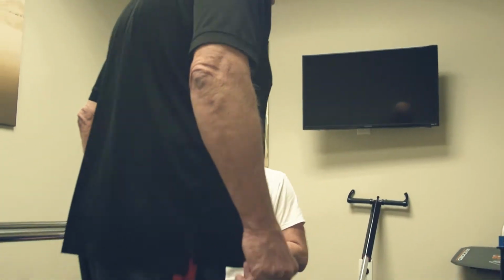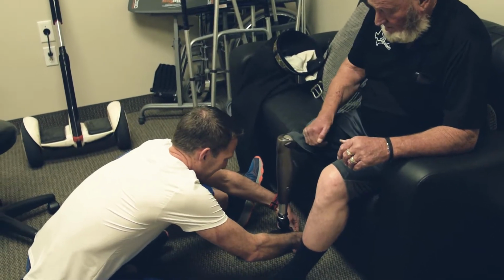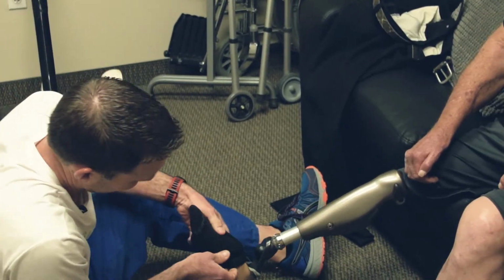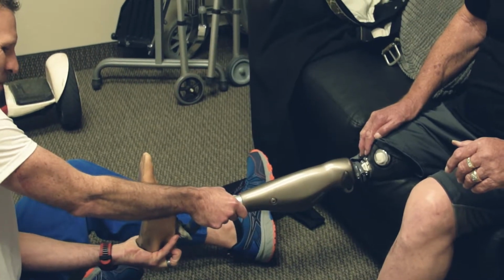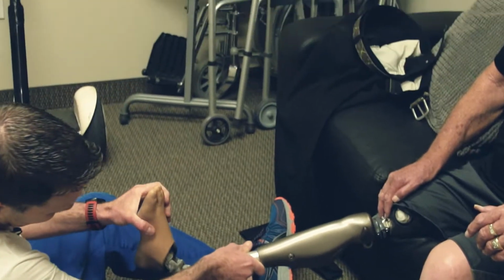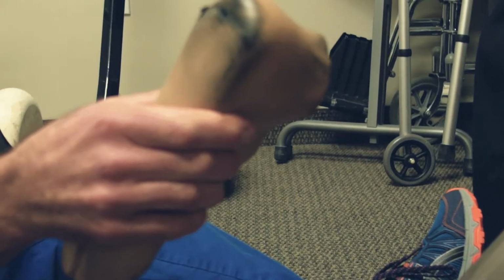Actually, all right. Let's have a seat. I need to look at something then. Okay, you want me to take it off? No. Leave it on. Not yet. I need to look at this. If you're telling me it's causing holes in your shoe, then we need to look at what this is doing. Yep. All right, there you go. So you're eating through the bottom of the foot shell. Oh man, I wish I'd seen this earlier. God, I did kind of wear it out, huh? That's why it's eating through your shoe. When you told me that, I said immediately I know what's going on.